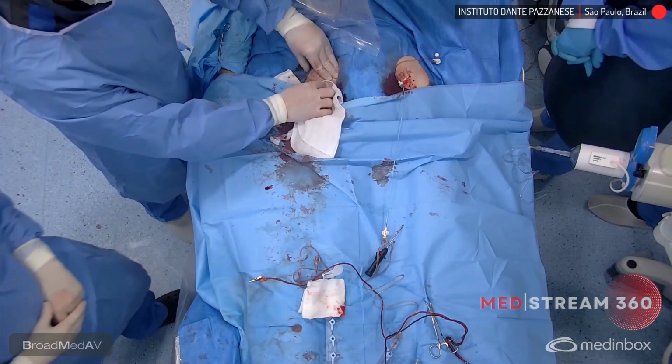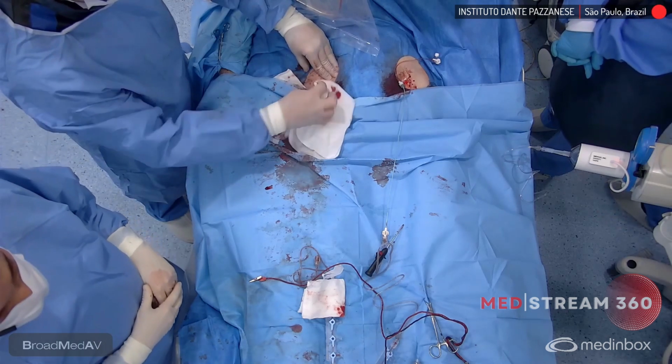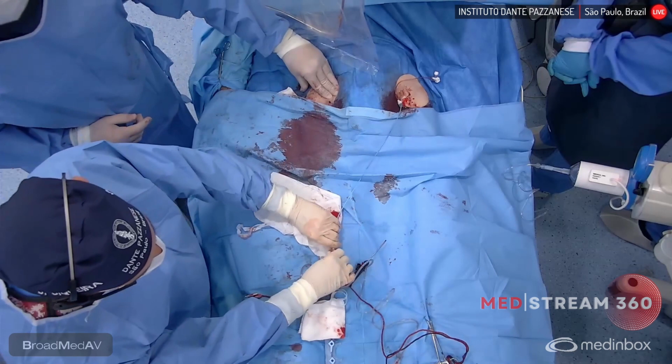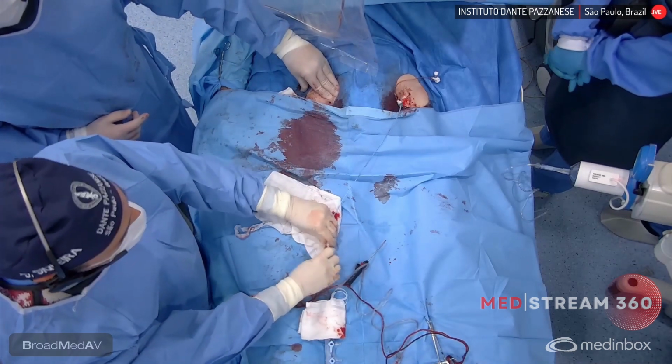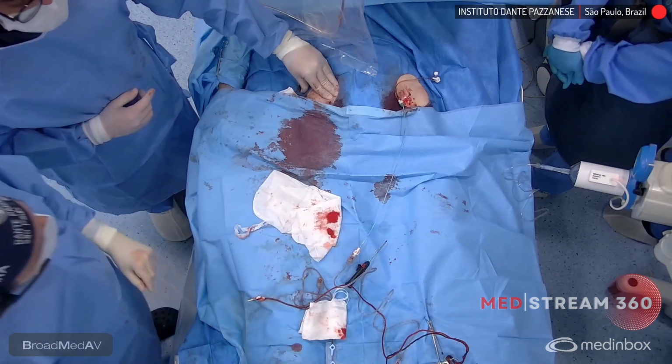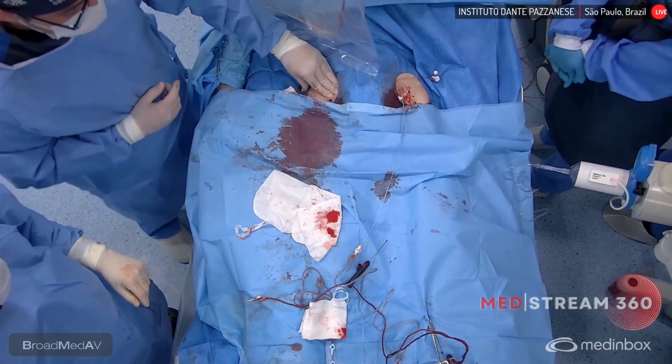Yeah, yeah. So, if you remember, we have a 5.2 femoral artery diameter. Is that correct, Dimitri? Yes. You know, Alberto? Yeah. So we are a little bit lower than the minimum. Yeah, well, we're pushing the limits a little bit. Yeah, you push it there.